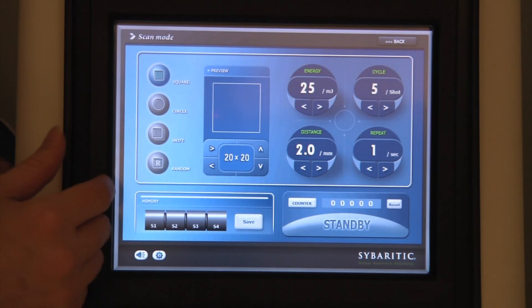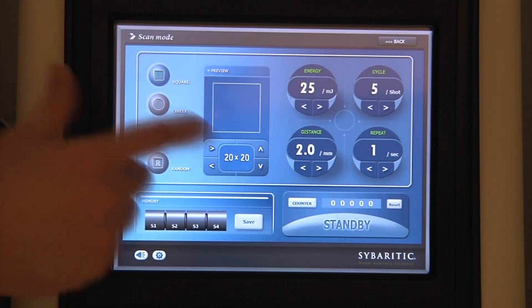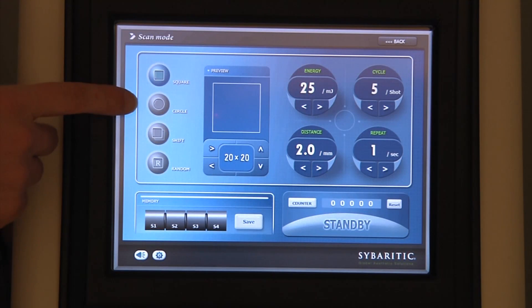However, we can independently control the dimensions to create rectangles and other shapes. We can also select a circle if that's the spot area that's desired.